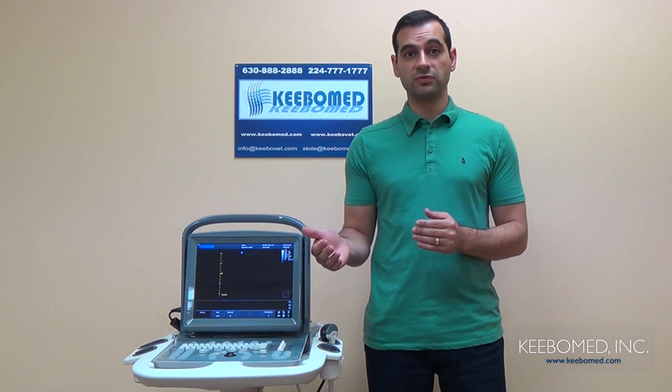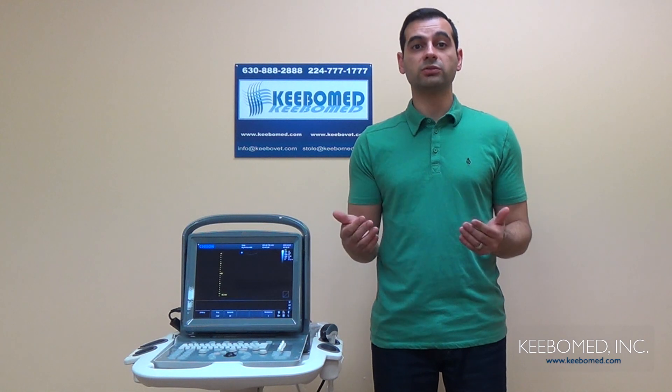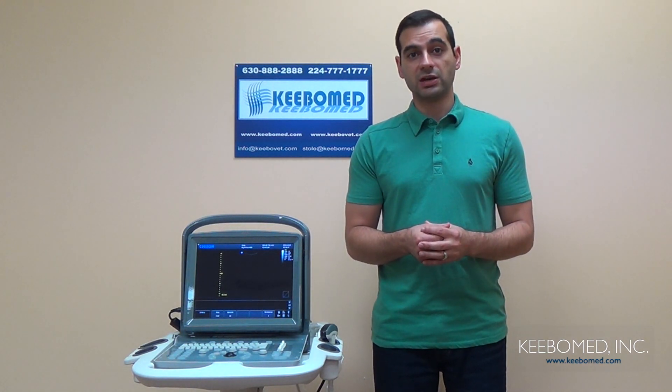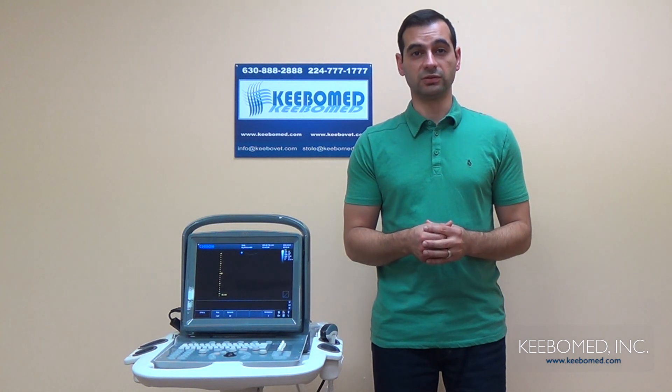The Eco1 has proved to be very compact and lightweight. It weighs only about 13 pounds, whereas other ultrasounds can weigh up to 22 pounds. It also has a long battery life of two and a half hours and has a lot of accessories that can be used with it. Those include a carrying case, a specific trolley for the Eco1, and a waterproof keyboard cover.